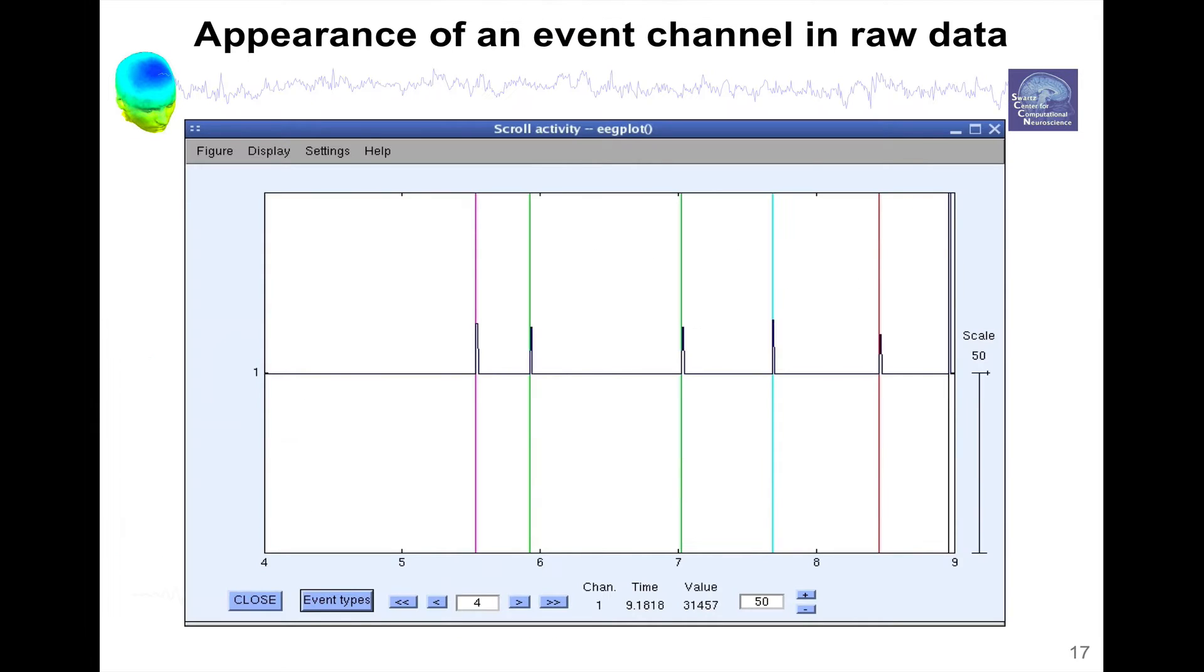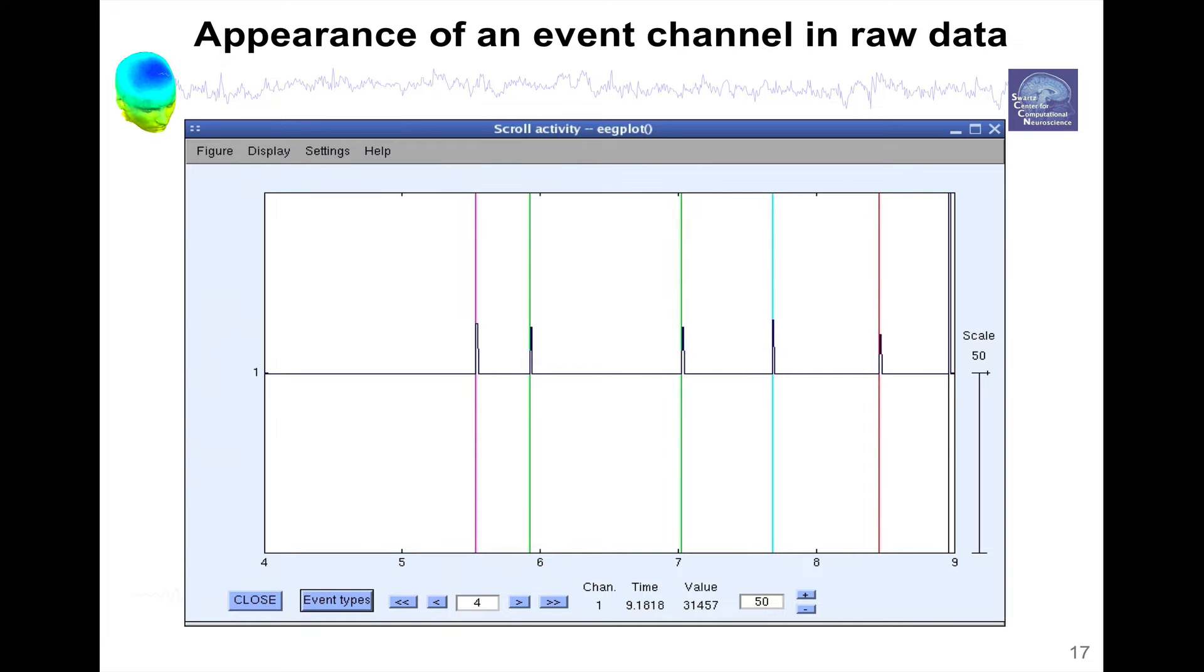So if you press OK on that menu and then you go look at the data, you don't delete the event channel. Here only the event channel is represented. But just for representation purposes, only the event channel is represented. We can see here vertical lines. The vertical lines of different colors are the events and the black trace is the event channel. EEGLAB has extracted different events and the color of the event depends on the amplitude of the channel.